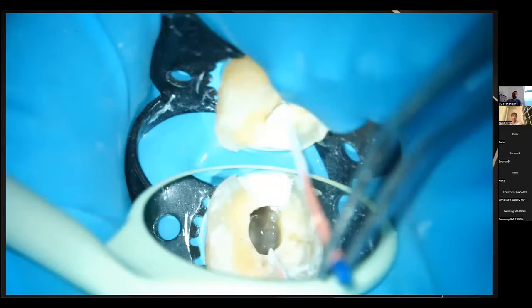Yeah, particularly on curves and things like that. It's like with any sealer, as soon as you touch the wall, most of your sealer's gone onto the canal walls rather than in the actual canal. And without the microscope, it's unlikely that I would have ever seen this, to be honest.